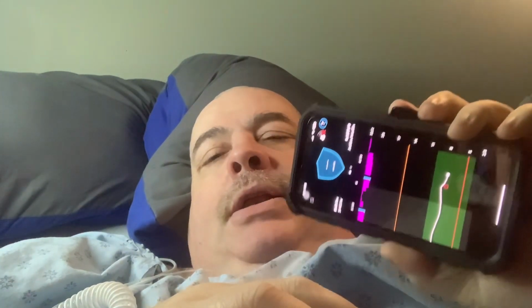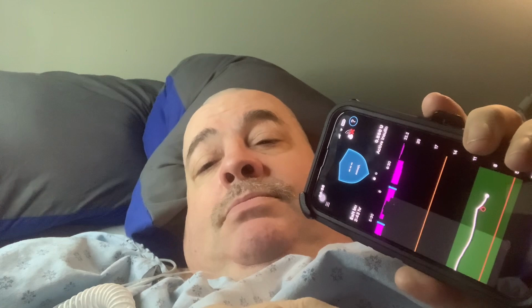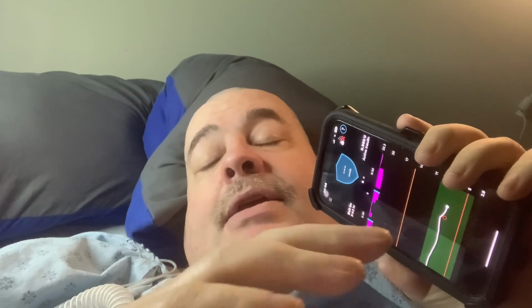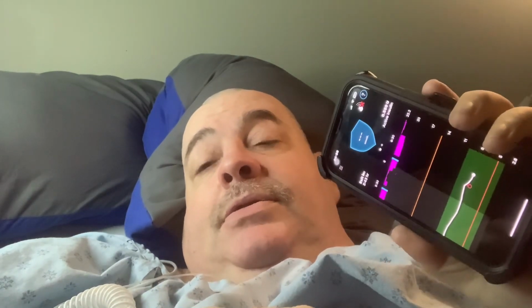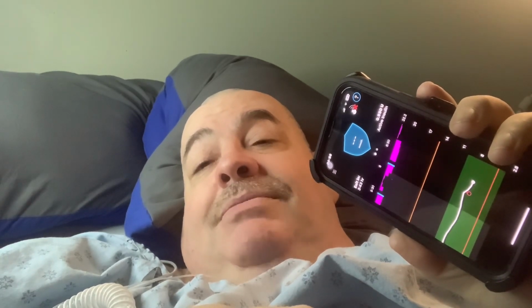For me, I look at it, okay, I deal with it. Don't be the one that's checking, oh, well, that's saying that. What's this saying? Oh my God. A lot of these CGMs will beep at you if something's wrong. My pump in a moment will beep to me saying this cannot find the sensor, which is fine. We haven't done anything with the sensor yet.